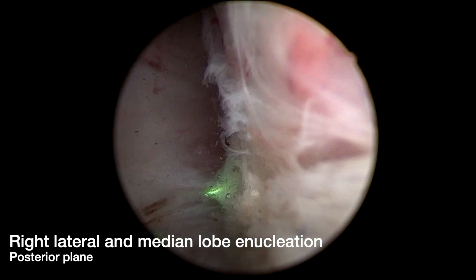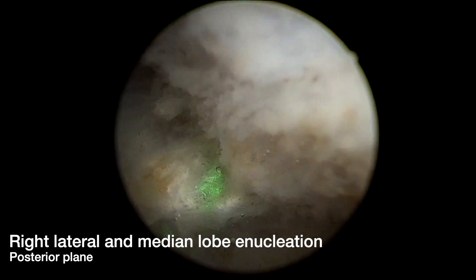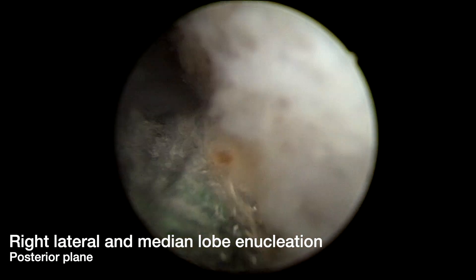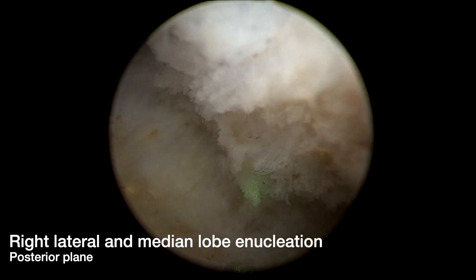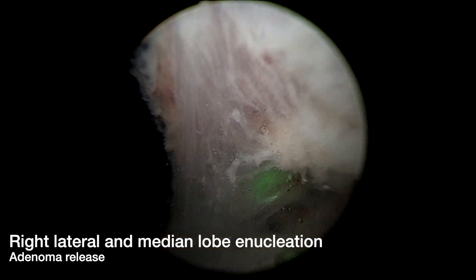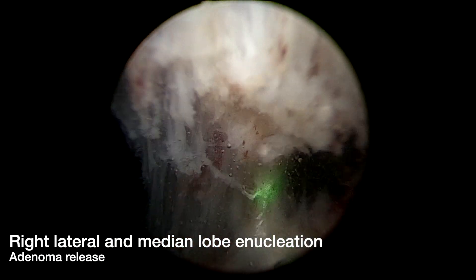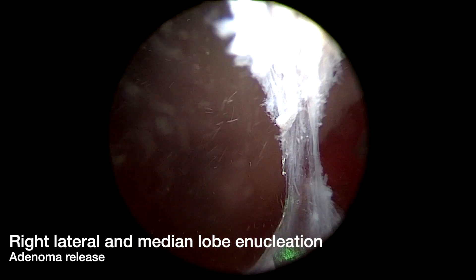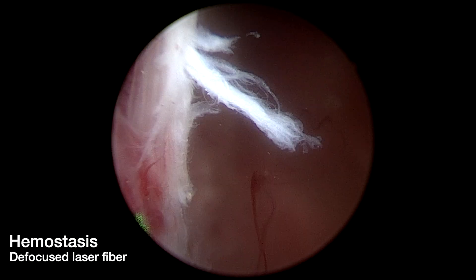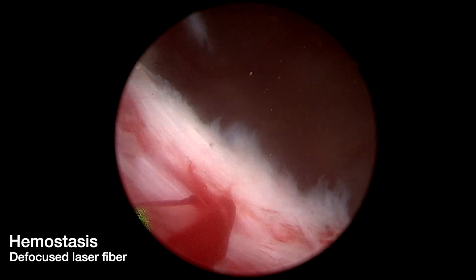It is important to ensure that the mucosal bridge between the 11 o'clock and 7 o'clock position is fully excised. Following this, in a retrograde fashion, we release the right lateral lobe and median lobe into the bladder. Hemostasis of the right lateral lobe and median lobe bed is again achieved with a defocused laser fiber.